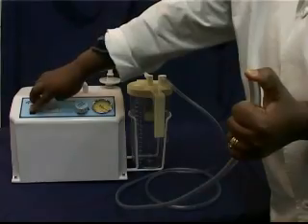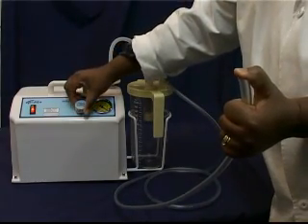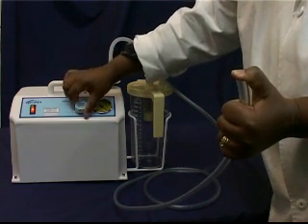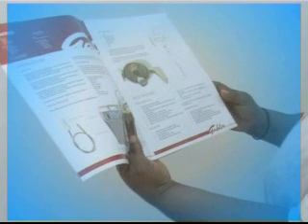When the motor is running but there is a weak or no vacuum indicated when the patient tube is closed off, it means that there is a pressure leak somewhere in the circuit. Detailed instructions for locating the pressure leak are included in the printed version of this video. They can also be found in the user reference manual.